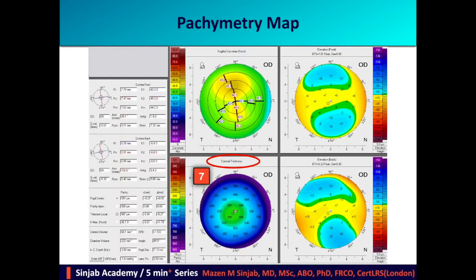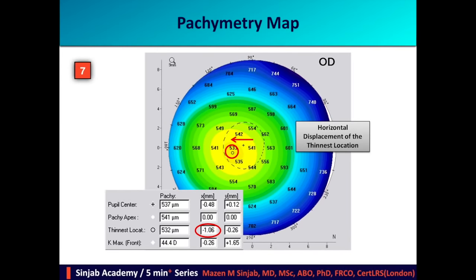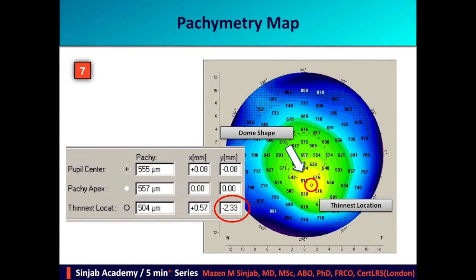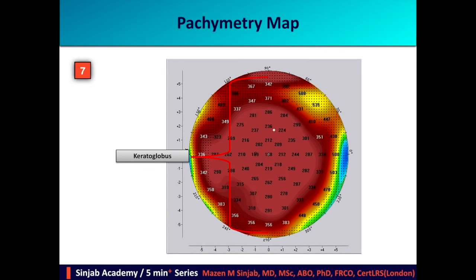The pachymetry map: we have to look at the pattern. The normal pattern is the disc or concentric form. A horizontal displacement of the thinnest location can occur with misalignment during capture or large angle kappa. The dome shape — a vertical displacement of the thinnest location — is characteristic of ectatic corneal diseases in 90% of cases. The bell shape indicates inferior band thinning and is a hallmark of pellucid marginal degeneration. The keratoglobus pattern shows generalized thinning extending to the limbus.